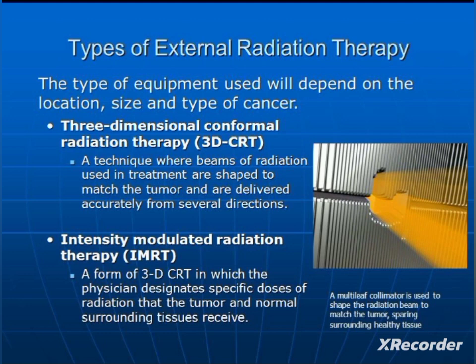Next one, image guided radiation therapy, that is known as IGRT. Here we are using CT or MRI in order to give the accurate doses to the tumor.